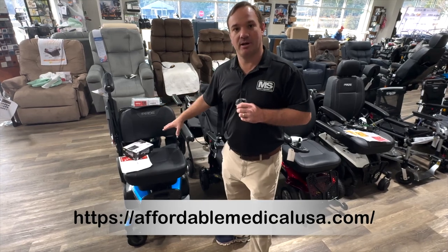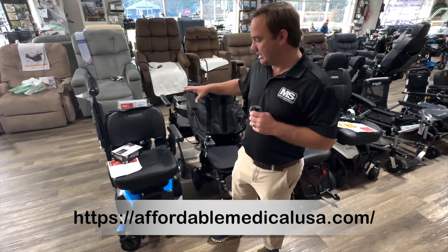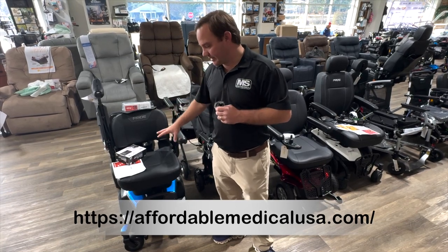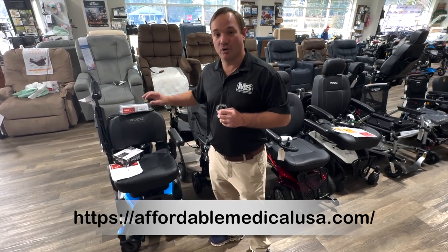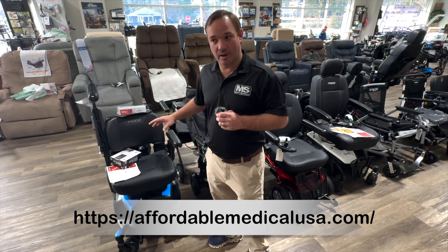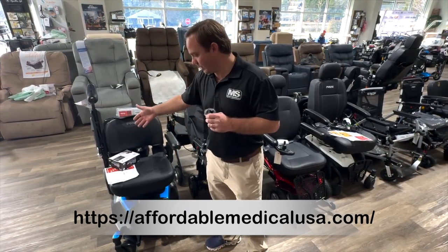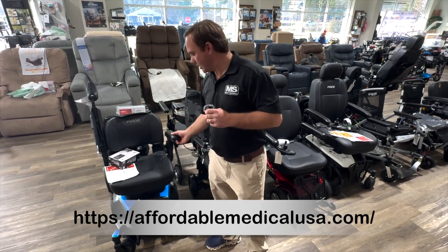It's the Go Chair. Done a box video recently — another one. You can get this in two different seat widths. It disassembles very nicely. Great chair for inside the house. Very small — I think it's 23 and a half inches, maybe 22 and a half inches in width from wheelbase. The arms will adjust — arms can adjust up, out, flip back.